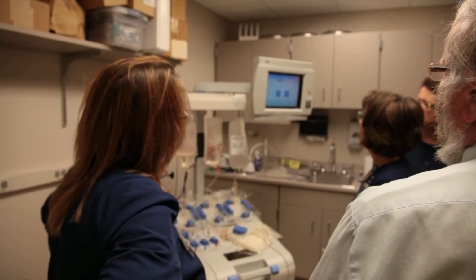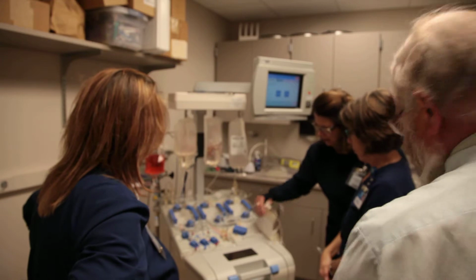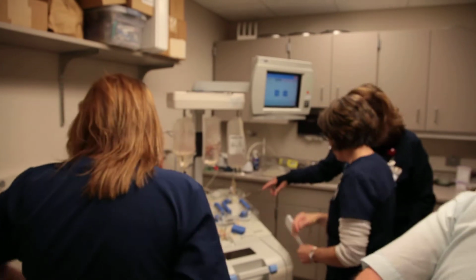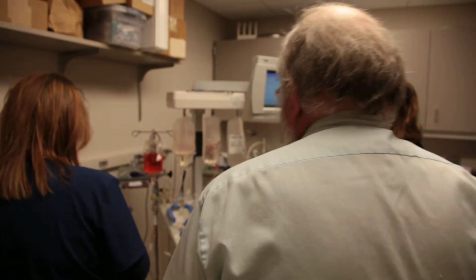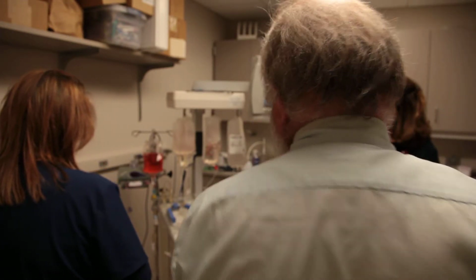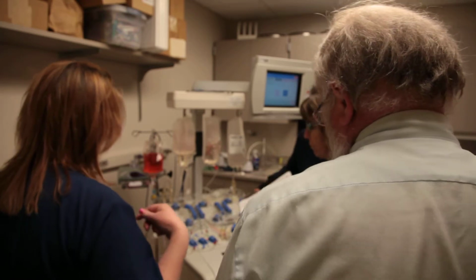And you're going to go ahead and start your manual. Make sure you don't get anything dripping on here. Where's our line? It's over there. They're already primed to the ends, but we would go ahead and push your start. And once it lets us, we'll stop.